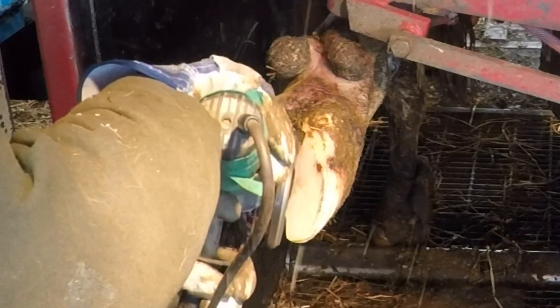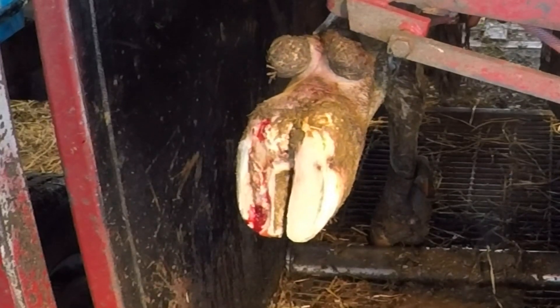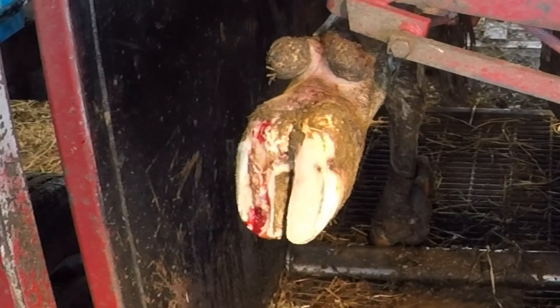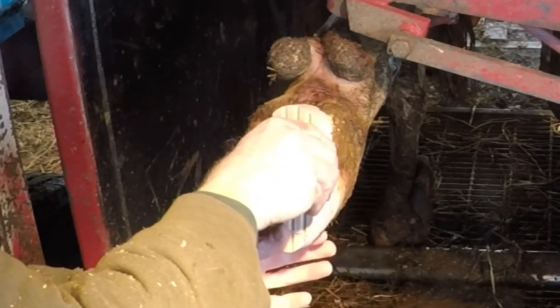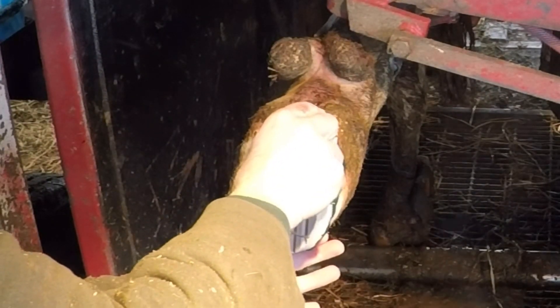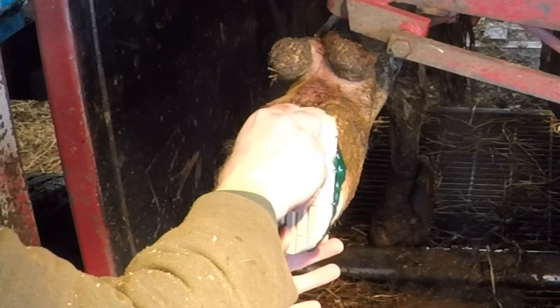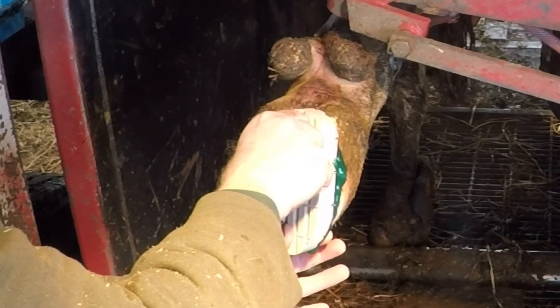Now all that's left to do is to trim up this lateral claw and apply a block. This block I'm going to glue on to that lateral claw, and it's going to elevate that medial claw — that damaged inside claw — allowing it to rest and to heal without having any pressure put on it from the ground or any abrasion from anything it may come in contact with. This block should stay on a couple of weeks and we'll check it again. It may need to stay on longer, but at least a couple of weeks.